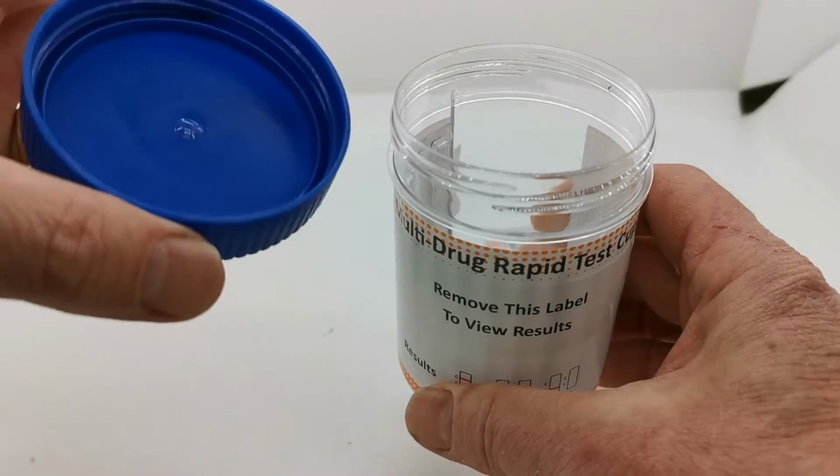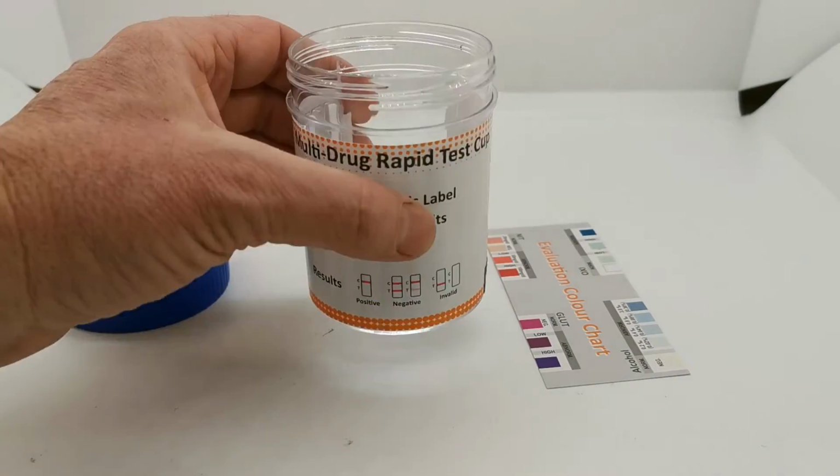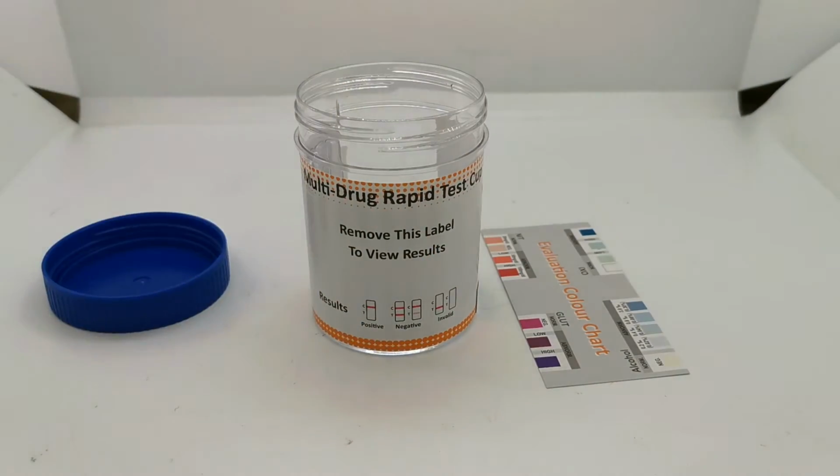Now the cup lid just screws on and off and you have a good size sample cup to give to the donor, and that is simply passed to them and they are asked to provide the urine sample ready for testing. We're going to freeze this video now and show you this cup with a simulated urine sample in it and the next step of the testing procedure.